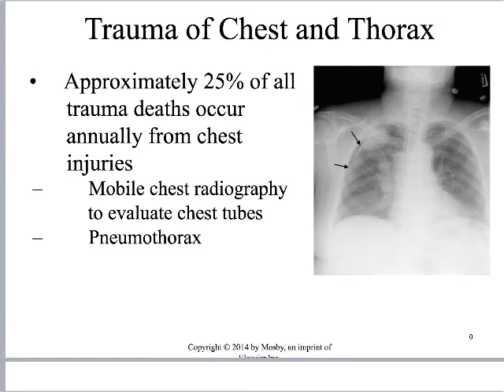We're going to breeze through trauma of the chest and abdomen, because X-ray has its role in this, but much of this will be referred to other modalities. It's about 25%. Let me make sure that is still the case. Yeah, the textbook still says 25% of all traumatic deaths occur from chest injuries alone. So this is the case for portable chest X-ray as that front line, as we're stabilizing the patient. We can get in pretty quickly, do that chest x-ray, and move on.